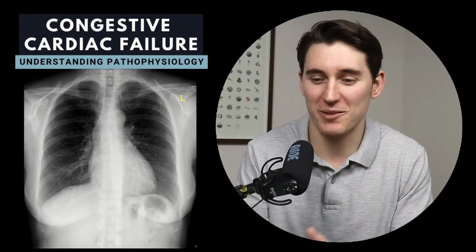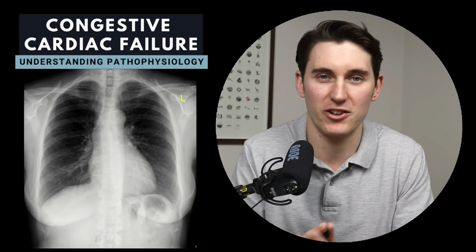Hello everybody, welcome. Today I'm going to share with you the features of congestive cardiac failure on a chest x-ray.